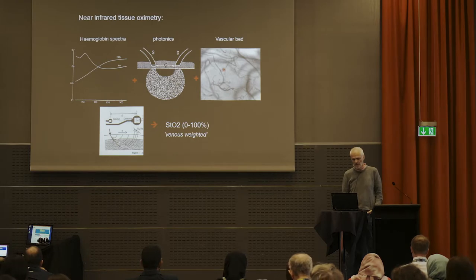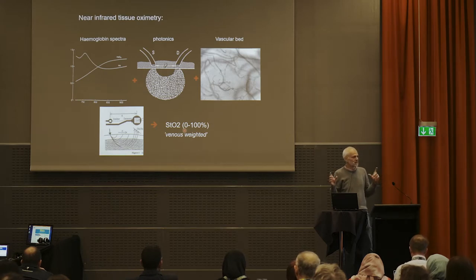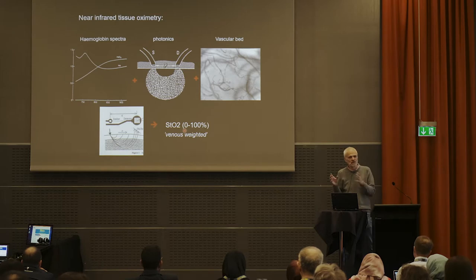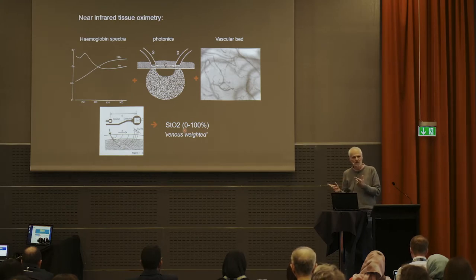And since blood is in the vascular bed, you can have blood outside, obviously, if you have a hemorrhage, but if you don't have a hemorrhage, blood is in the vascular bed, and most of the vascular bed is veins. You can see the thin arteries and the heavy veins. So two-thirds to three-quarters is in veins, and that means that we have a venous weighted measure. And by detecting light at some distances here, you get an absolute measure in a range 0 to 100, just like a pulse oximeter. So that is pretty simple in concept for a clinician to use, except for remembering this is not a pulse oximeter, this is a tissue oximeter. It is not venous, but it's a venous weighted measure.